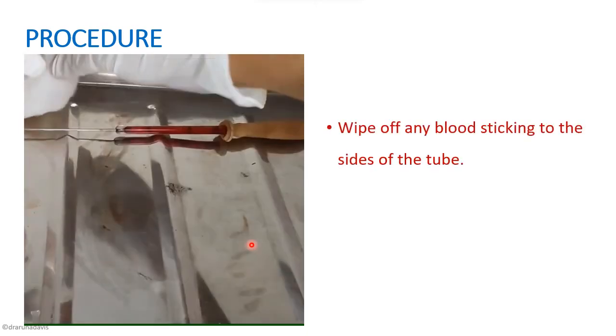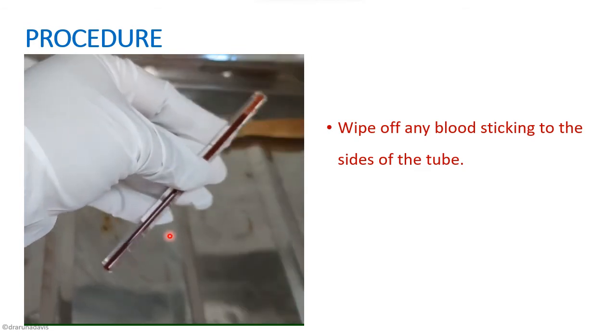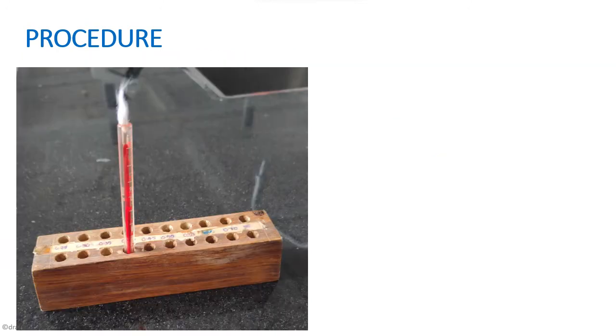Once filled, we wipe off any blood sticking onto the sides of the tube and plug it with cotton to prevent evaporation. As you can see, the blood is filled up to the zero mark and there is no blood sticking onto the sides.